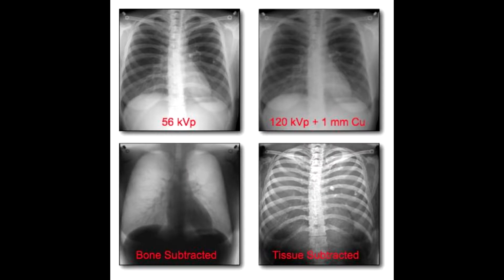It can affect your subject contrast, which is kind of a detailed area, but it changes your grayscale based on how much absorption versus how much hits the IR. If you have a thicker patient, you're going to need a higher kVp in order to penetrate those soft tissues.